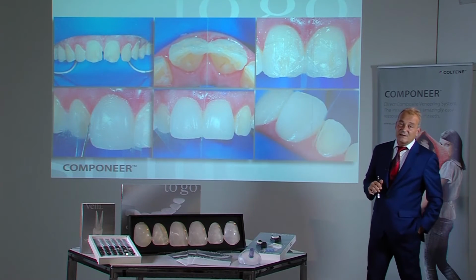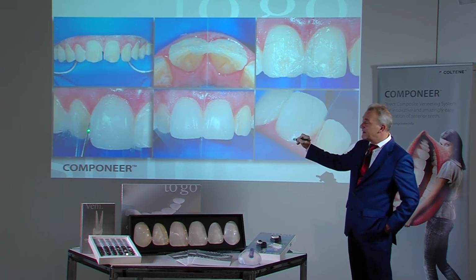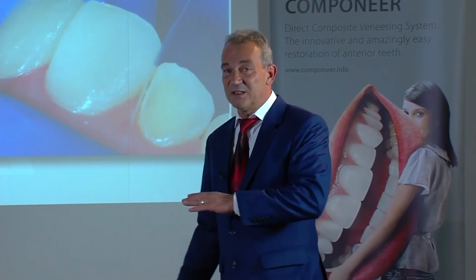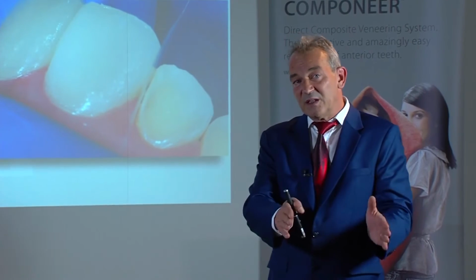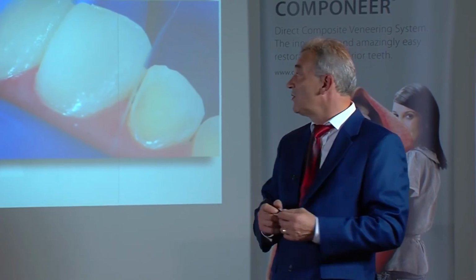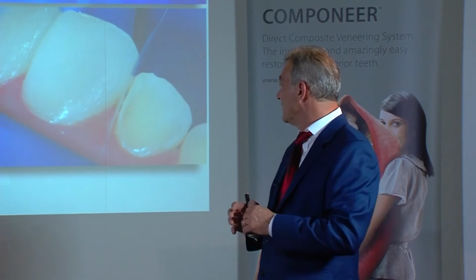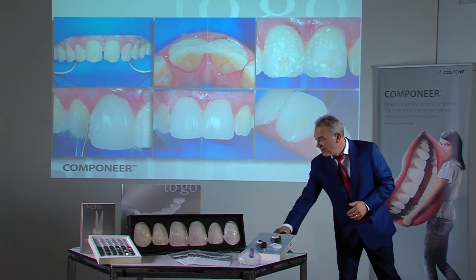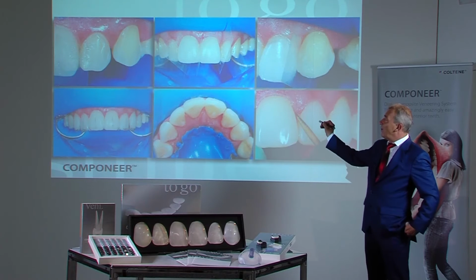In the case of smaller gaps, one should always take care to work with as little excess as possible. So if a componeer is placed, it is important to adapt or remove the excess composite material between the matrix and the componeer. Otherwise, this would result in a fine line of non-optimal material in the interspace to the next componeer, in other words, a border zone. On the right, one can still see a small gap between the 2 and the 3. It makes sense to fill or join this completely.